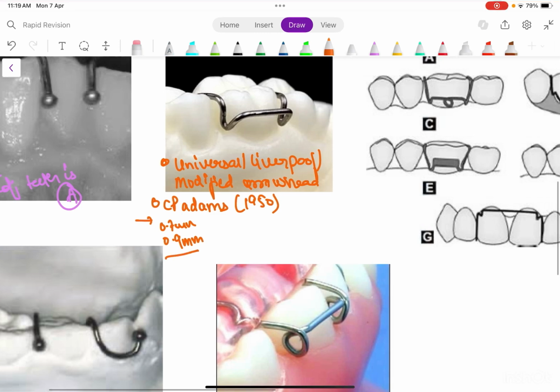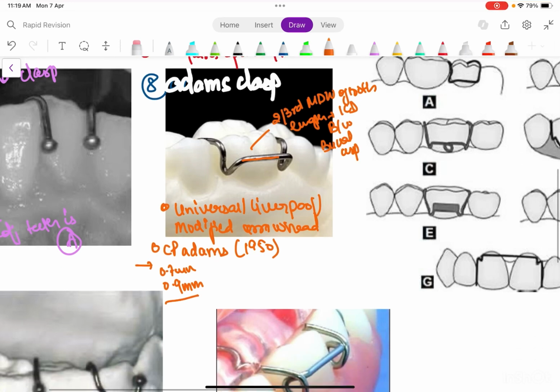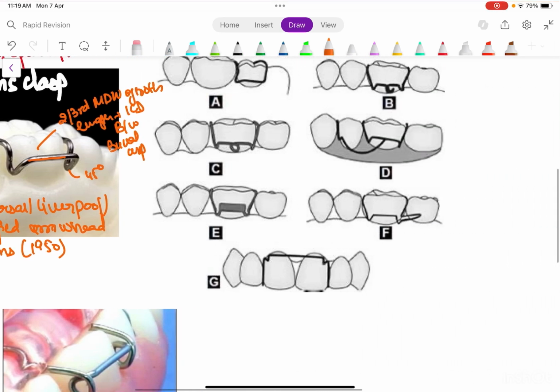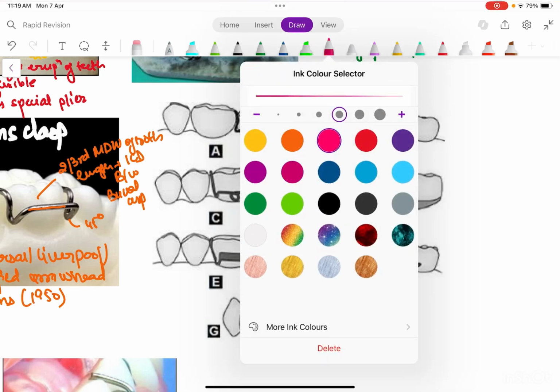Then this bridge should be 2/3 the mesiodistal width of the tooth, and length should be the intercuspal distance between buccal cusps. Then here we have a 45-degree angle. Alright, then coming on to the modifications. Now these are important and they are asked, so be thorough.